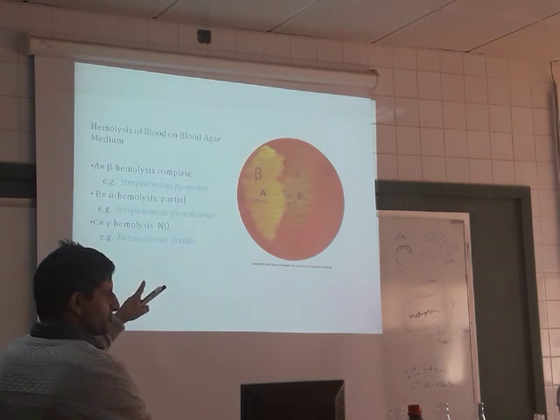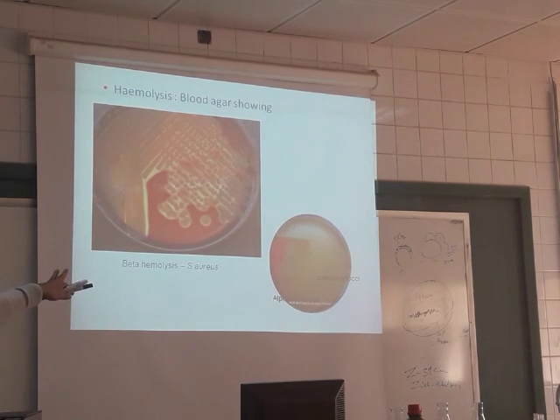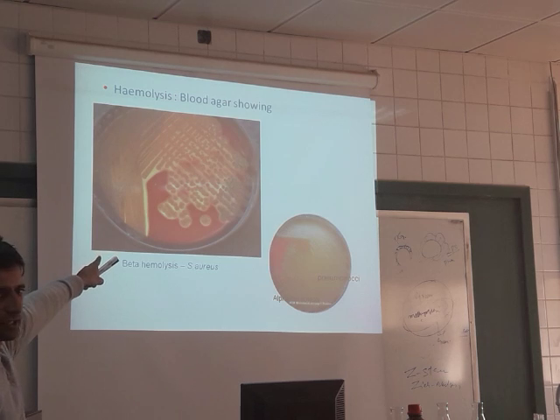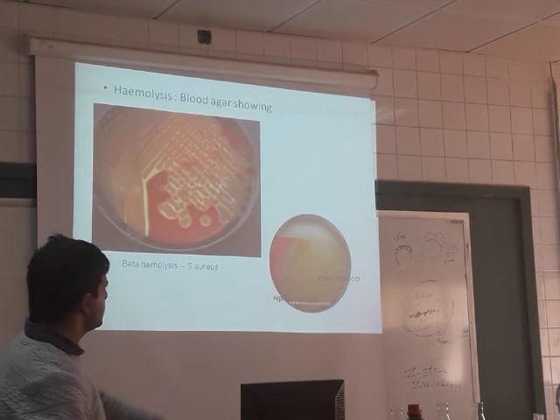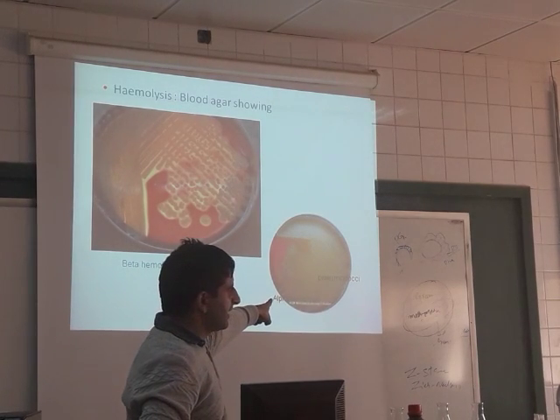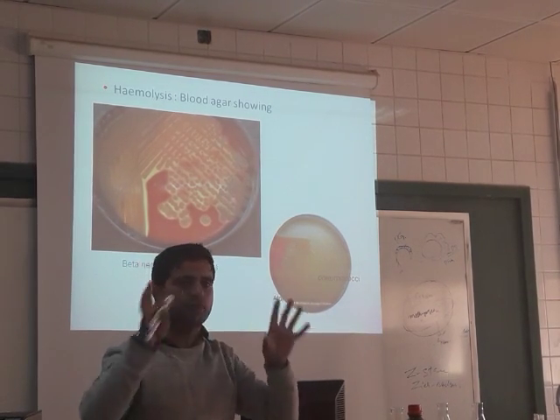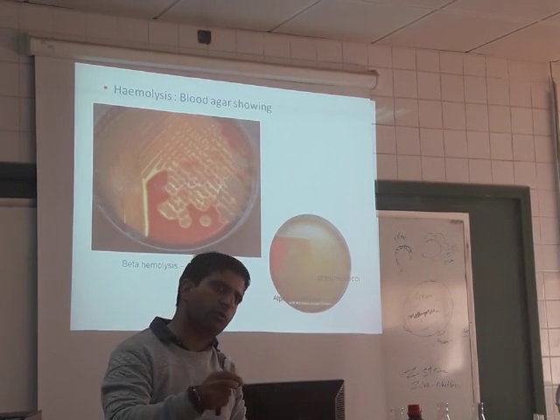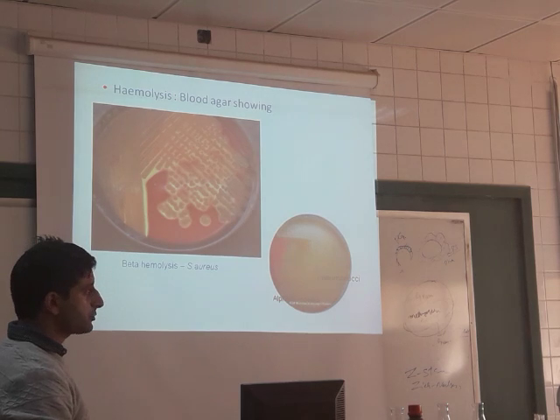So blood agar is understood? You see here the blood agar. In this blood agar culture plate, it's only Staph aureus. Complete destruction due to hemolysis. You see here alpha hemolysis, greenish color? Partial. Because it reacts with atmospheric oxygen, methemoglobin is formed, it gives its green color. Partial hemolysis. Understood this?